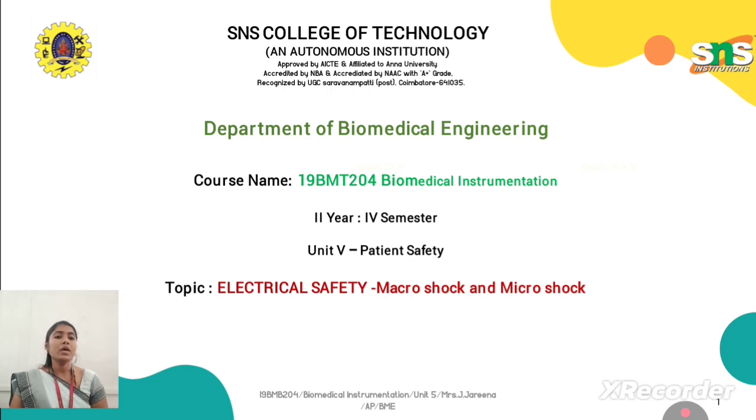and so on. So if there is any failure in the medical device, or any leakage current or short circuit happens in the medical device, it is going to affect the patient. So by ensuring electrical safety, we can promote patient safety.